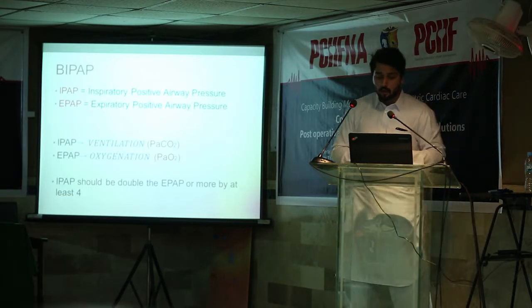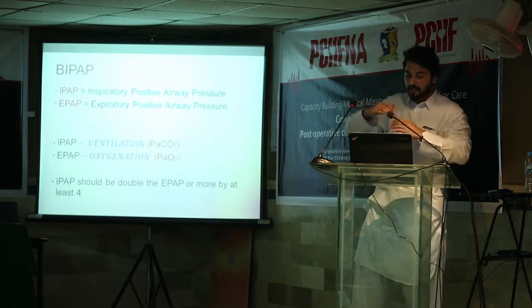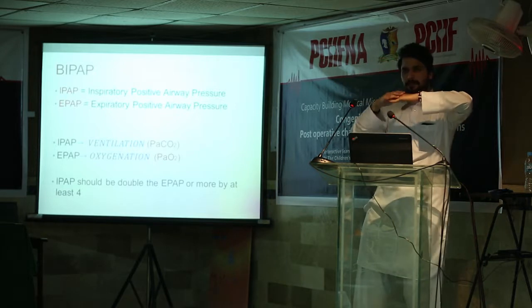BiPAP, or bi-level. What is bi-level? It's like CPAP, but above that there is an inspiratory pressure. So there is IPAP and EPAP. EPAP is like CPAP.